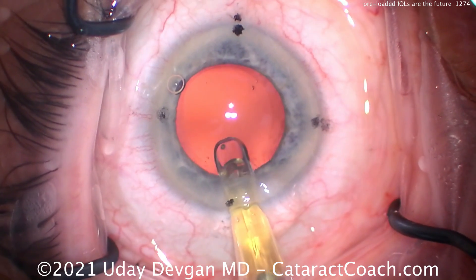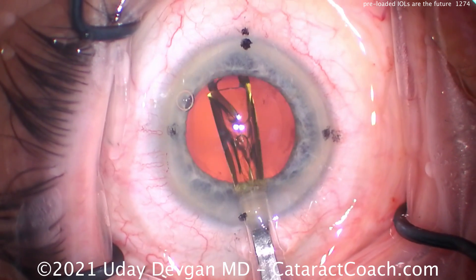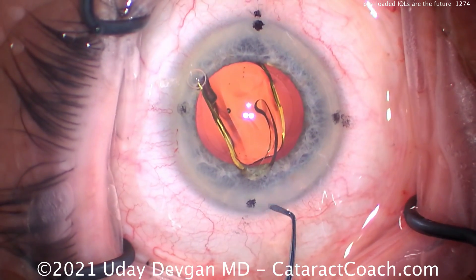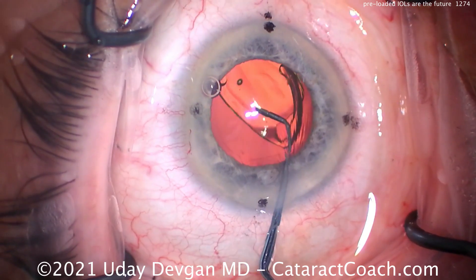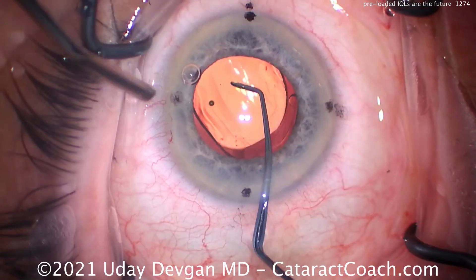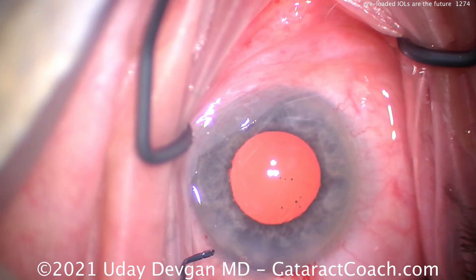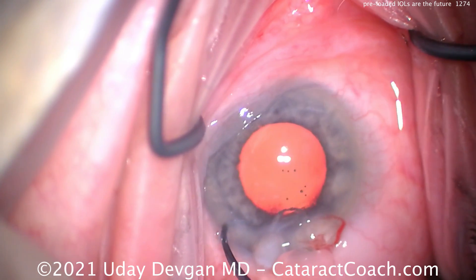I anticipate the company will come out with toric versions of these lenses. Looking in the crystal ball, I think all companies are going to have their entire range of lenses come preloaded. Right now a lot of the more premium lenses — bifocal, trifocal, EDOF lenses — don't come preloaded, some do. But the future is going to be moving to having all of them preloaded.